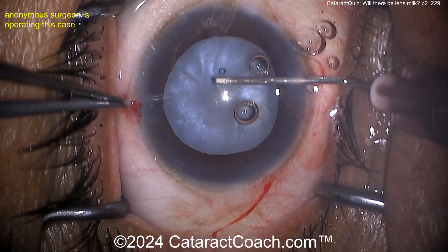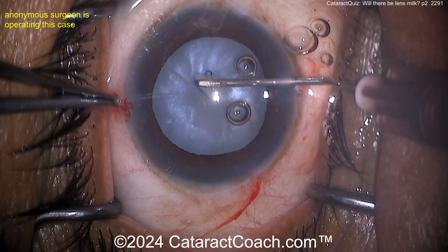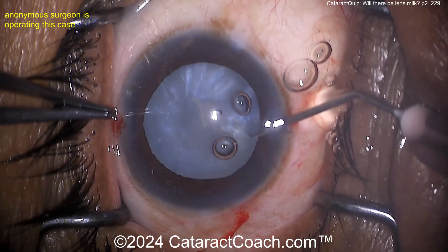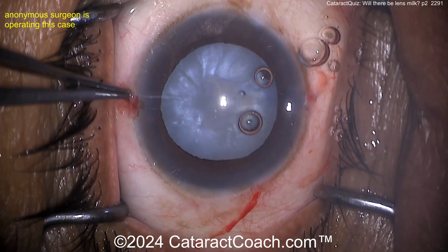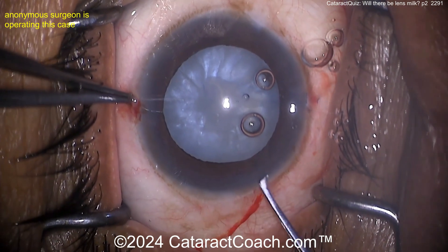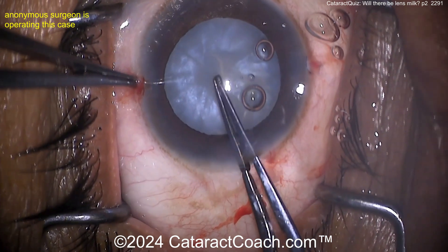Going into the side port with the cystotome — and there it is, there's the milk. Of course there's going to be lens milk here. Let's do a double rhexis technique. Push on that nucleus, get the fluid around it all coming forwards. It looks like a pearl — that's one of the giveaways this is going to be an intumescent case.